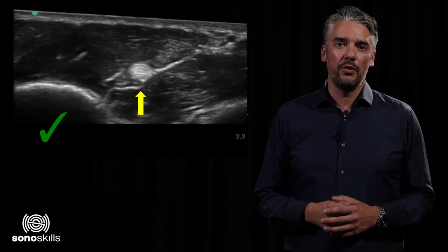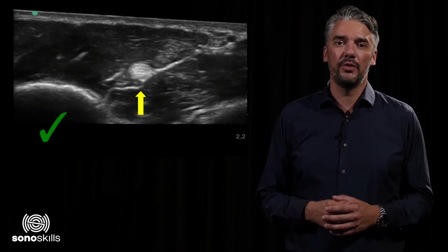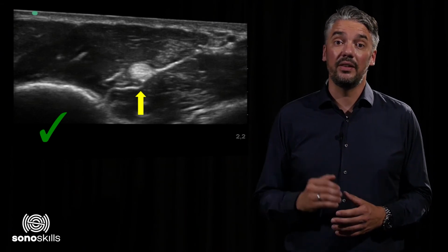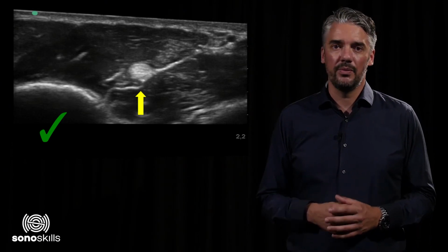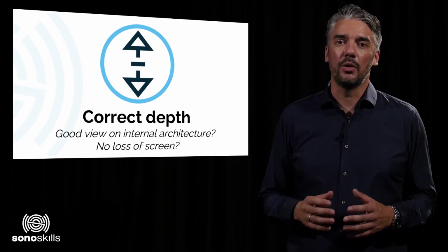The sonographer should also adapt and optimize the gain or brightness levels to each anatomical structure within a person. People who are new to musculoskeletal ultrasound tend to scan with a gain setting that is too high at the beginning. Please keep in mind the balance. The depth should be set at the level that places the region of interest in the majority of the screen.